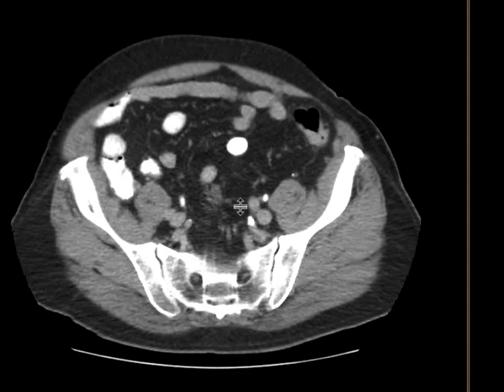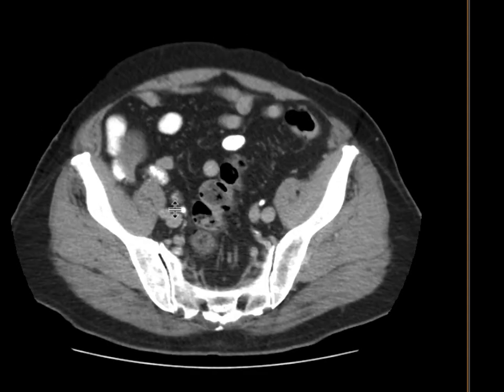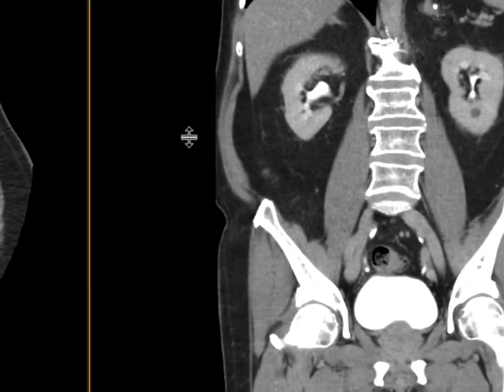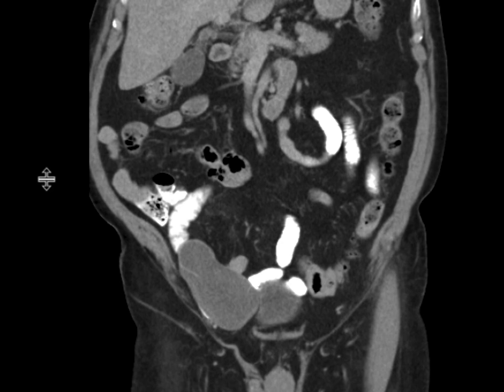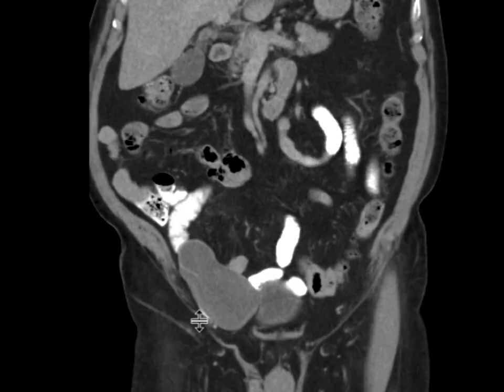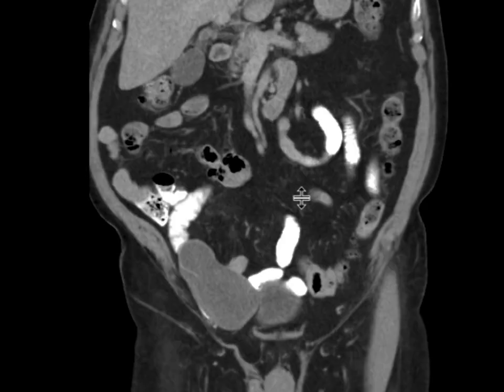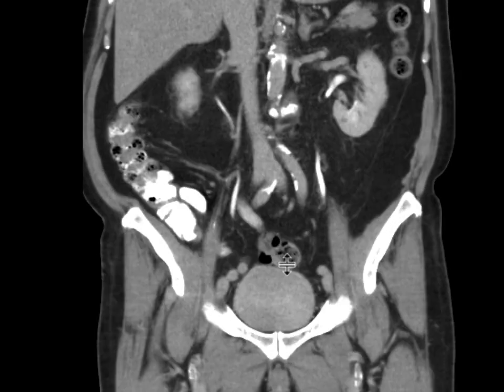If we examine this a little bit closer, we can see this is the terminal ileum here going nicely into the ileocecal valve, and that this structure really arises from the base of the cecum and extends down inferiorly. We can see this very nicely on our coronal CT images as well — this tubular structure. We can also see at the periphery there's a little bit of calcium, and it really arises from the base of the cecum right about there.